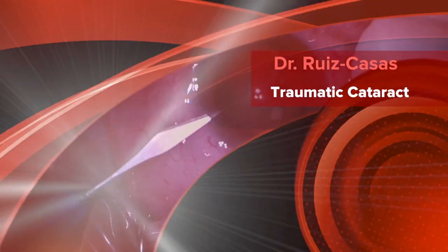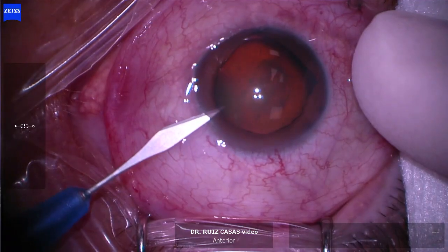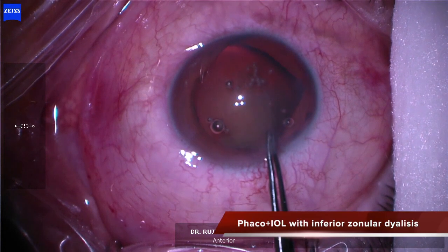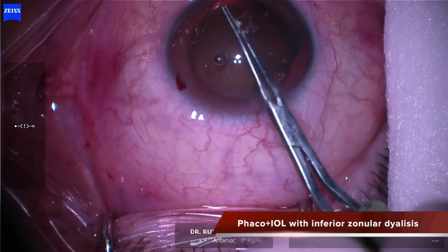This was a case of a traumatic cataract, very dense and long-standing. It had been present for almost 20 years, with an inferior zonular dialysis and inferior vitreous loss because of the trauma.